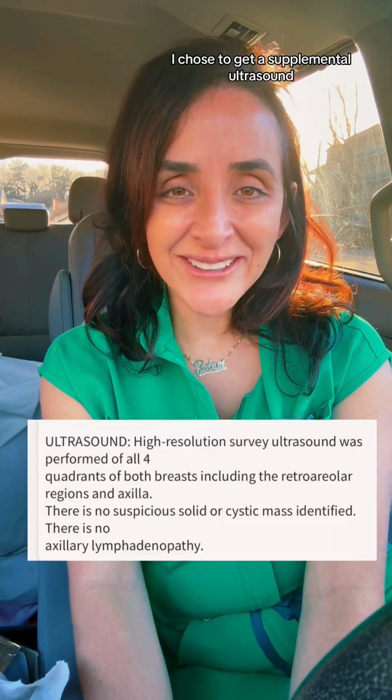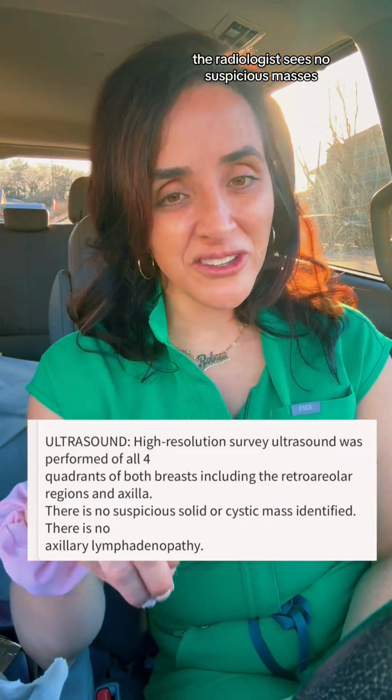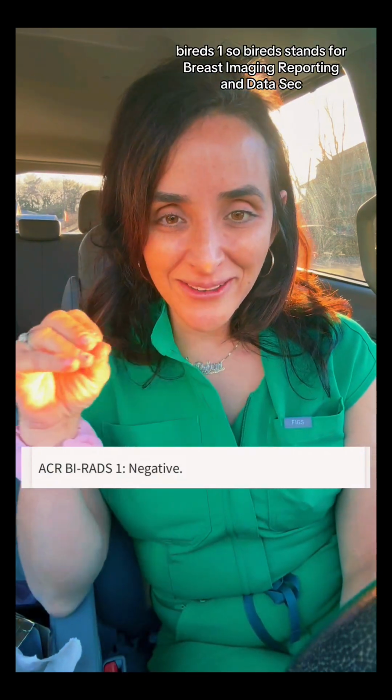Because I had dense breast tissue, I chose to get a supplemental ultrasound. That allows us to see through the breast tissue a little bit better. The radiologist sees no suspicious masses. So under here, you're going to see negative mammogram and ultrasound BI-RADS 1.